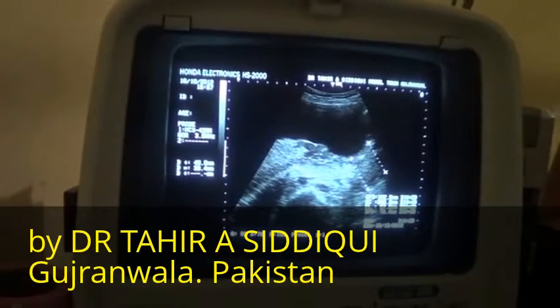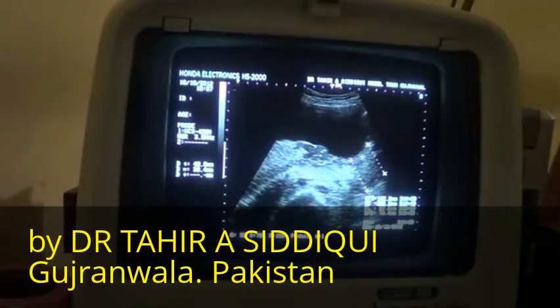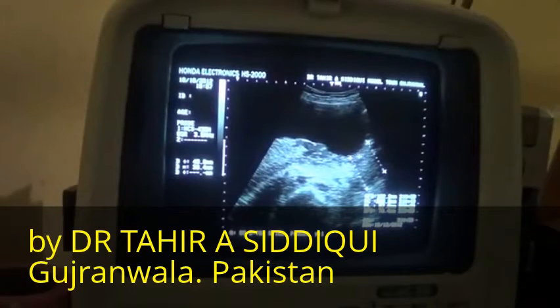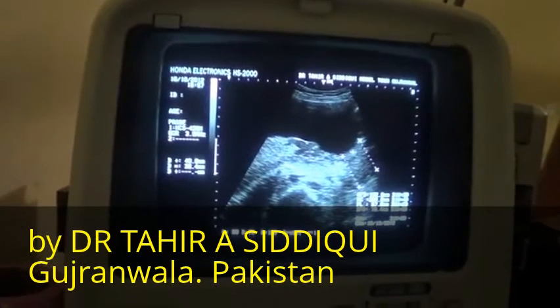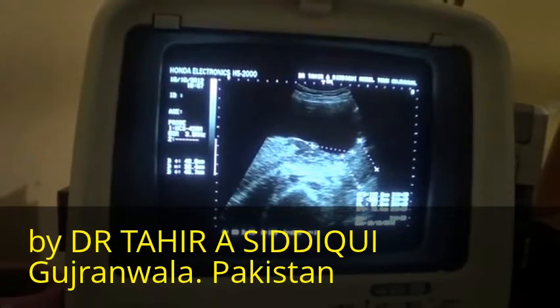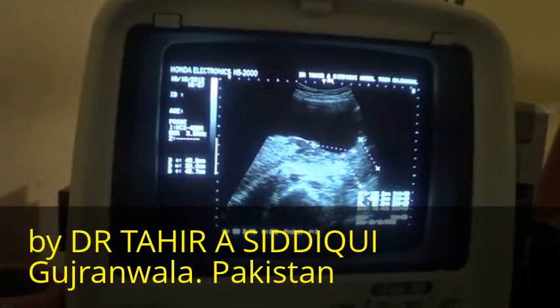And this central echogenic line that you are seeing is the cervical canal, which is closed, and this area is that of the internal os, and the placental margin is placenta.